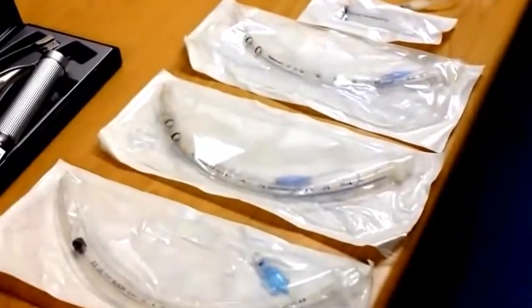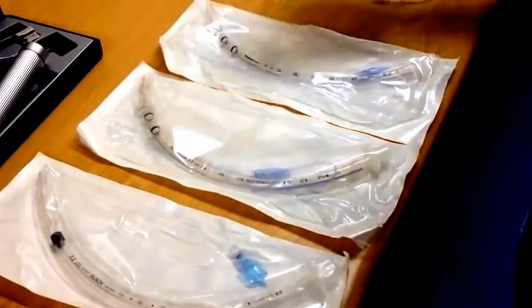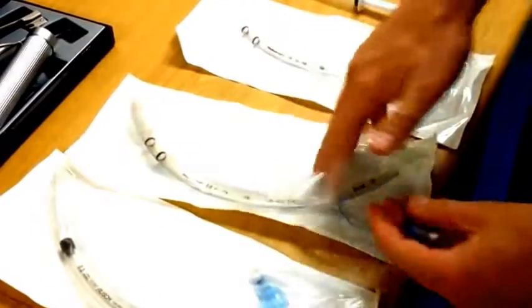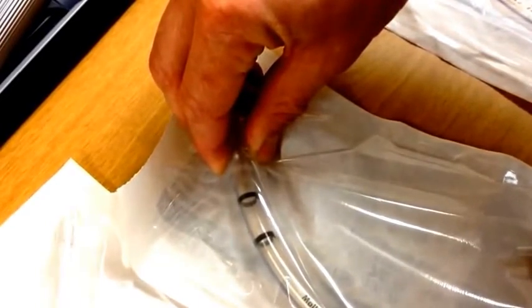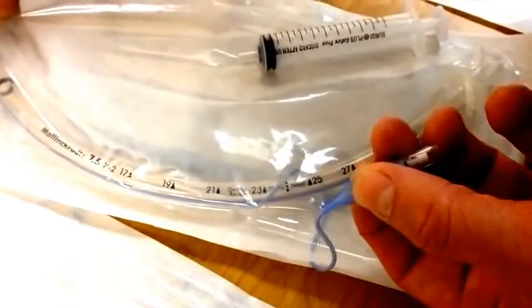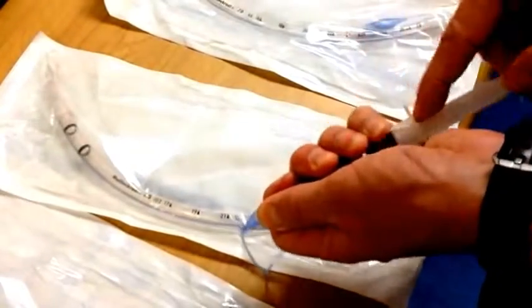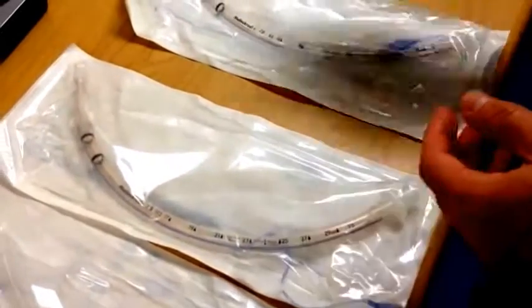The endotracheal tube should be checked for a functioning cuff without compromising the sterility of the ET tube. We suggest the following: open the syringe you're going to use, then open just a corner of the endotracheal tube packaging and retrieve the pilot cuff. Inflate the cuff while still inside the packaging and check it inside the packaging. Sustained pressure on the cuff for a few seconds, making sure that the pilot bulb remains inflated without losing any pressure, should be sufficient. At this time deflate the cuff completely, and your ET tube is now ready for use without having compromised the sterility of the tube.